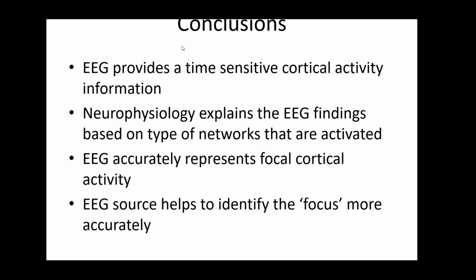Questions just keep coming in. So this one is asking, what is the explanation from a network perspective for increased spiking that can be seen during sleep in some epileptic patients?